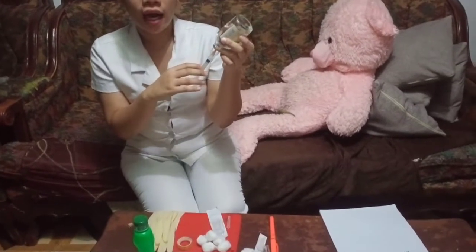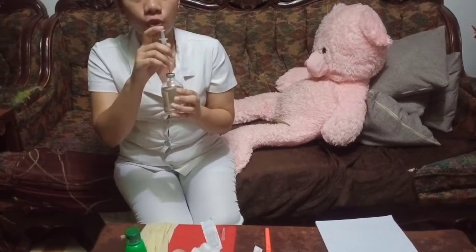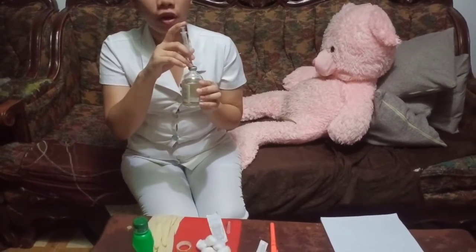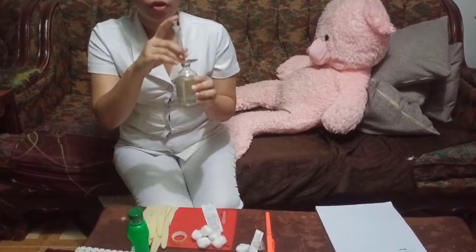Hold the vial down and move the needle tip so that it is below the fluid level, below the medication. Invert the vial, ensure that the needle tip is below the fluid level, and gradually withdraw the medication.